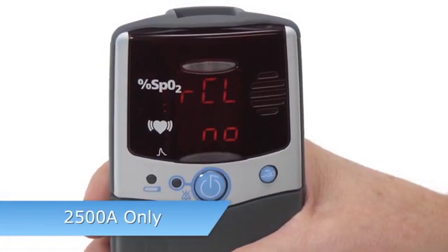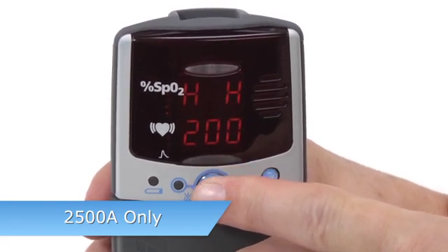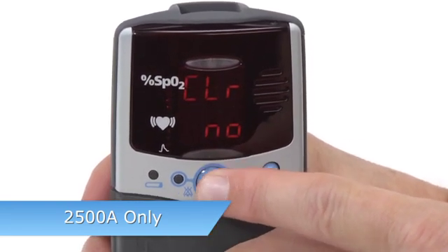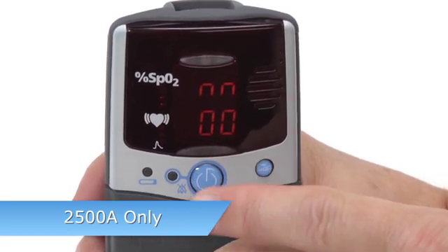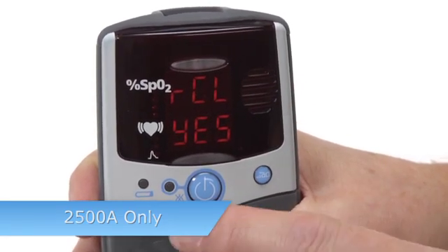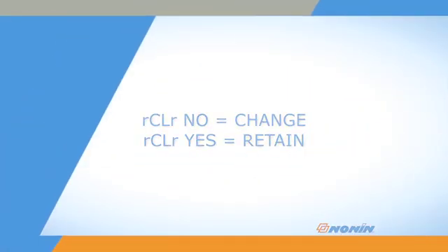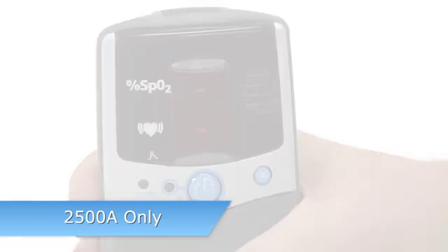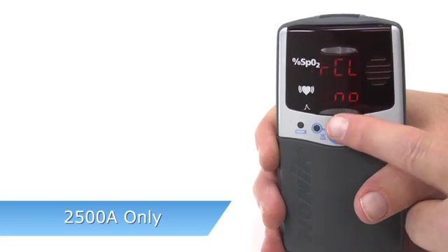For the 2500A model, when you enter Setup, the Recall alarm values NO option appears first, followed by memory clear. Date and time settings follow after alarm settings. If you clear the custom alarm setting, the oximeter will return to its default settings. Press ON-OFF to clear the custom alarm settings, or use ADVANCE to select YES to retain the custom settings. If you retain the settings, you will automatically exit Setup Mode.